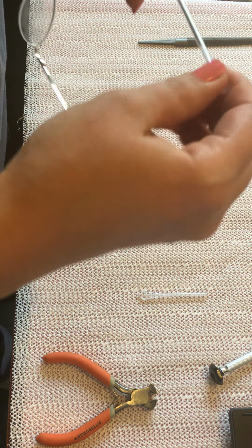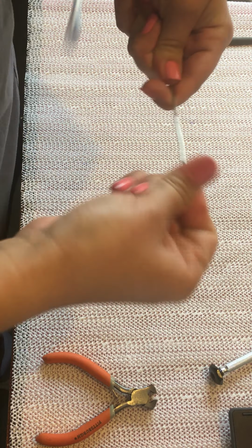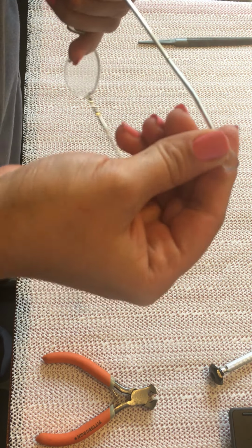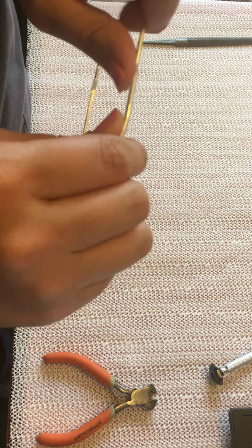Okay, so we would just wiggle it in. And now we have one temple tip. We will wiggle the other side. Wiggle. Okay, it's good. Okay, and now what we're going to do is we're going to have to do the bend. A 45 more or less bend. This one, I could already see the one that it had. So that's where I'm going to go with on this one.